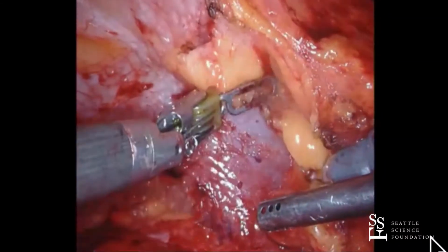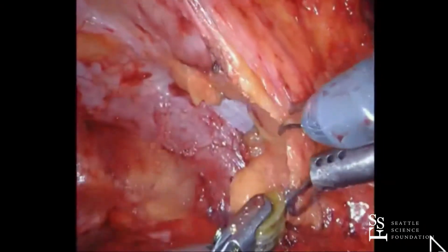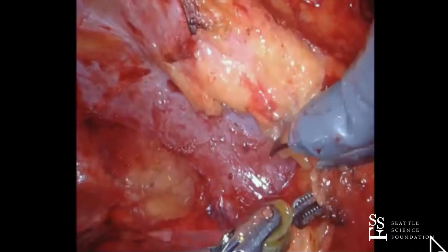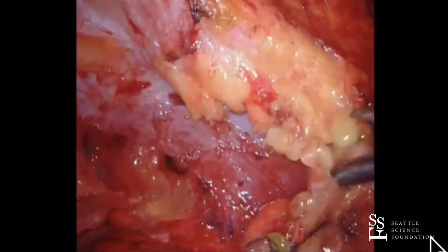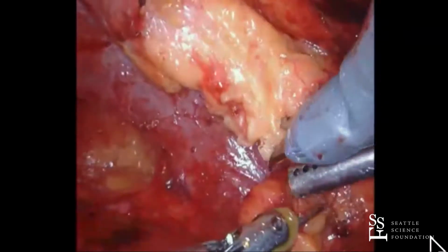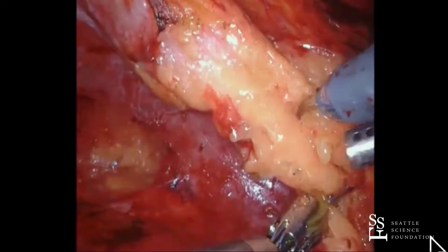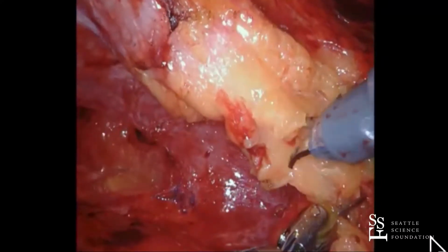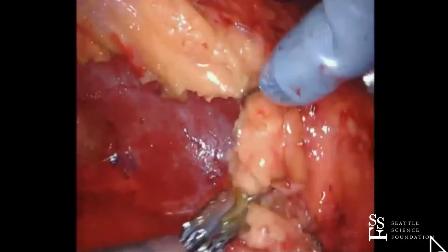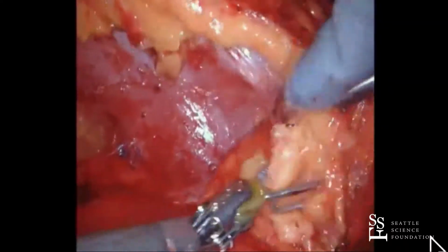One of the things that I'll mention too that's really helped me, because again, I'm a relative novice, I've only done about 30 of these, is I'll pop the ultrasound in very early in the case. At this stage, I might put the ultrasound in and just get a lay of the land. Where's the upper pole of the kidney? Sometimes you get fooled. Sometimes it's much lower or much higher than you thought. So I'll just put the ultrasound probe in, find the upper pole, find the lower pole, I know the hilum's somewhere in between, and now I know where to start looking for my artery. I know Jim doesn't have to do that because he's very comfortable in this space, but there are fewer landmarks than what you're used to in transperitoneal, so one way you can compensate is by using the ultrasound very early.